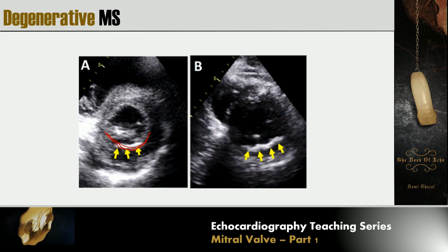And if the mitral annular calcification is occupying or affecting less than 1/3 of the posterior annular area, then it is mild. Moderate, 1/3 to 2/3. Anything more than 2/3, then it will be severe.